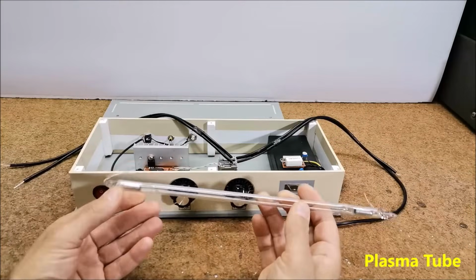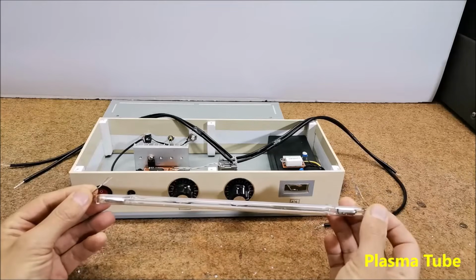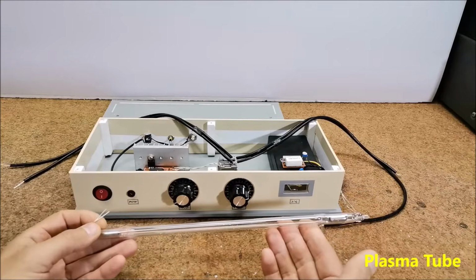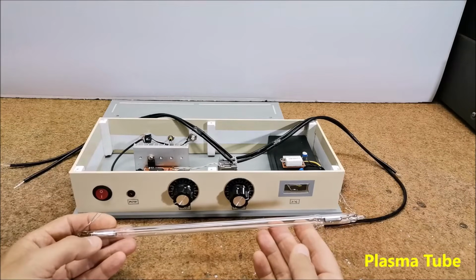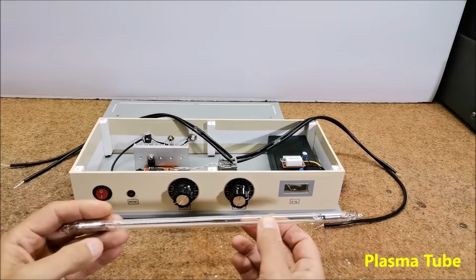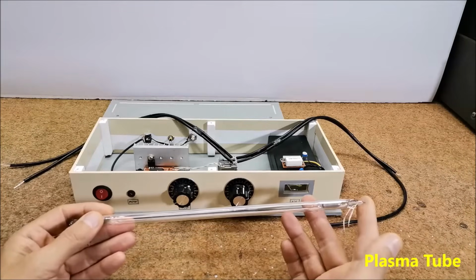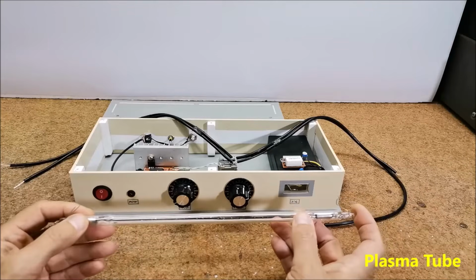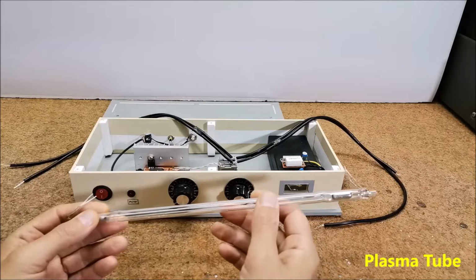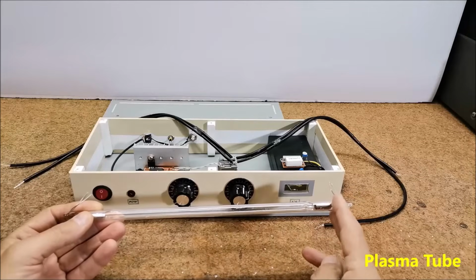And the last part is a plasma tube. This part is the most difficult to obtain, and it's often the main reason for avoiding the construction of a plasma Rife machine. Unfortunately, on the internet you can find countless Rife machines that work by holding metal electrodes in the hands, which is completely wrong and dysfunctional because, due to the skin effect, the high frequency currents move only on the surface of the skin and do not penetrate to internal organs. On the other hand, the devices that contain the plasma tube are extremely expensive.